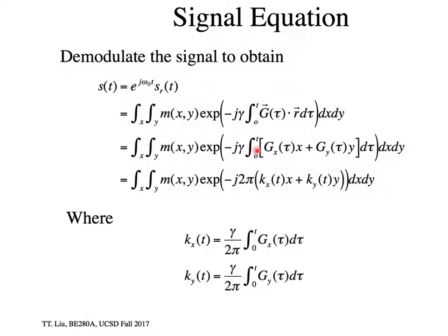And it's an integration over space, over dx and dy, where I look at the entire sample that I'm imaging. All of that sample is giving me contributions to my final signal I'm measuring. And so that's this integration over the imaging plane, X and Y.